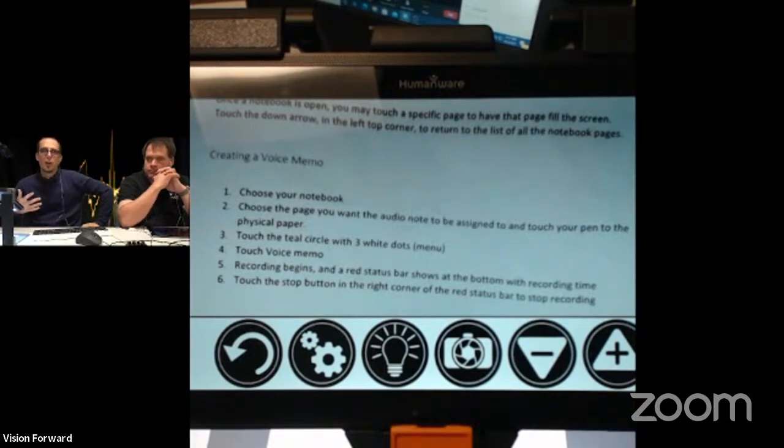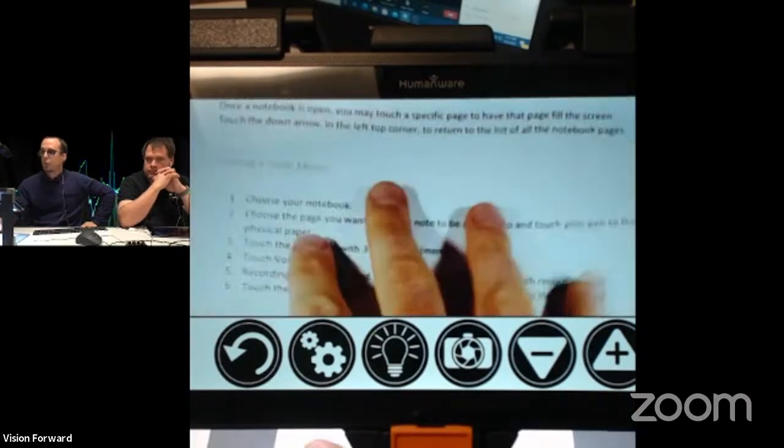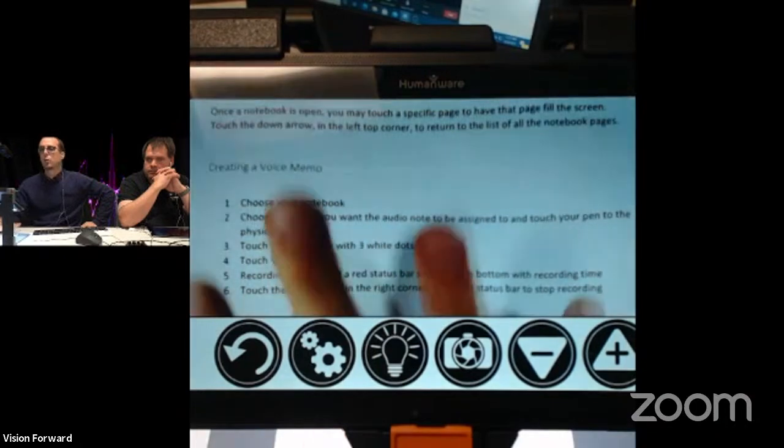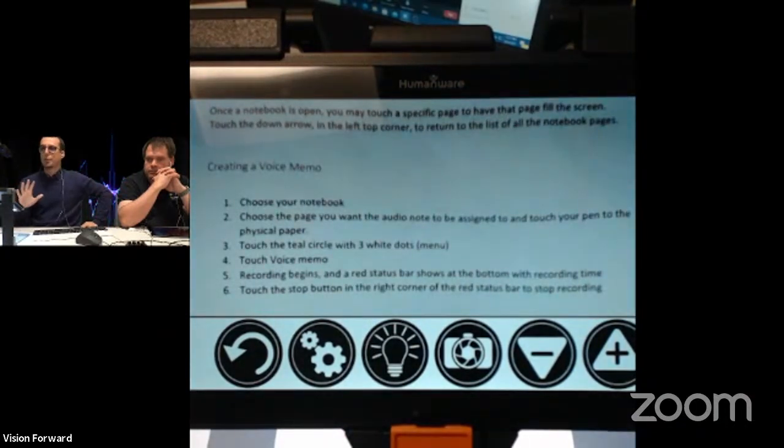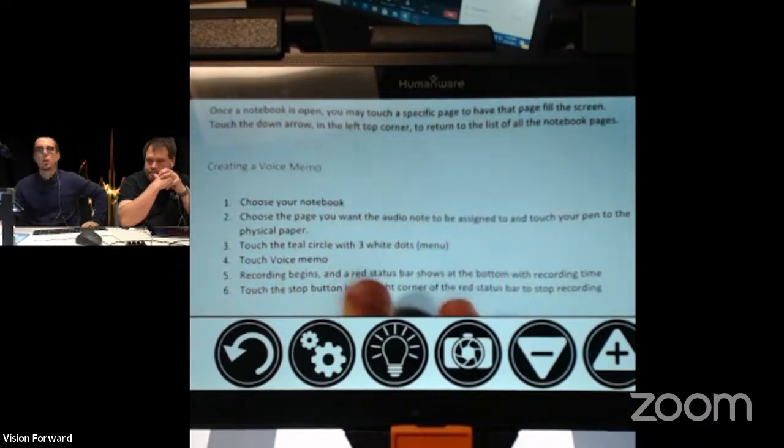So we have magnification, as you would expect. This is an electronic magnification device. We can turn on and off the built-in light. So if we're looking at a self-lighted object under here, we can turn off the light. But we also have full-page OCR. This is the ability for the machine to read aloud to us. We've already been talking about it a little bit. And so we can have an 8.5 by 11 underneath here and have the entire thing read aloud to us.